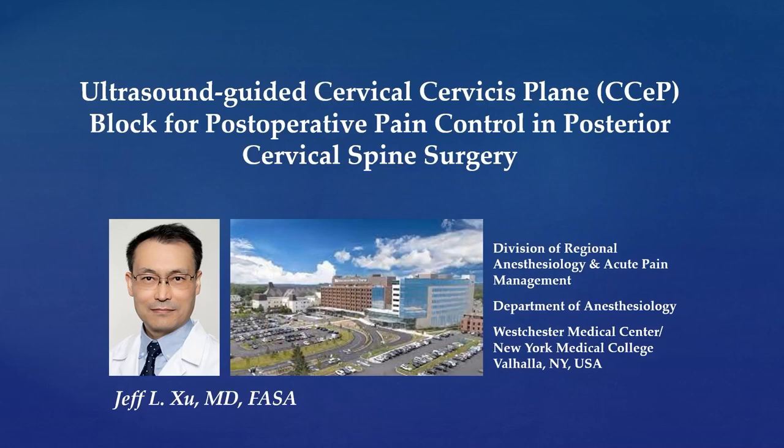This video is to introduce a peripheral nerve block for post-op pain control in posterior cervical spine surgery called Cervical Cervicis Plane Block, or CCeP block.